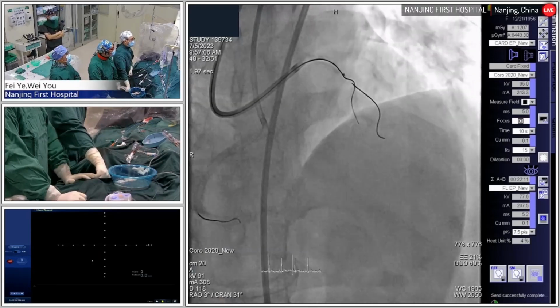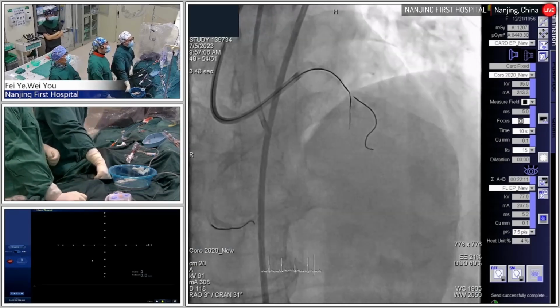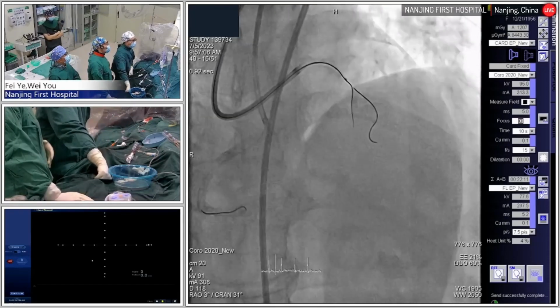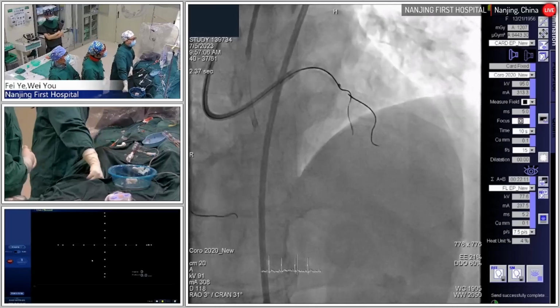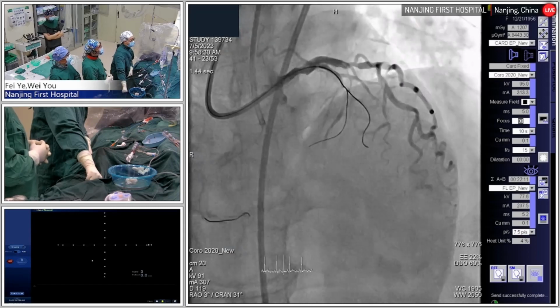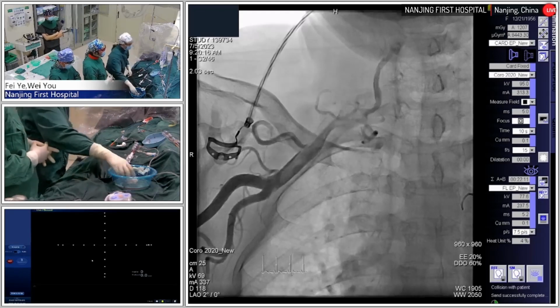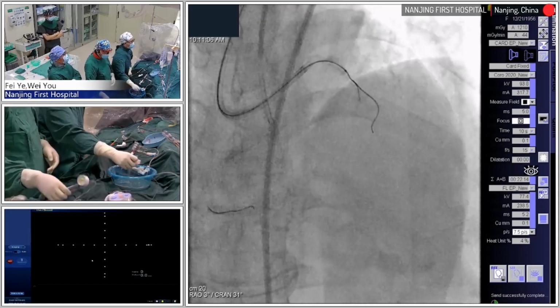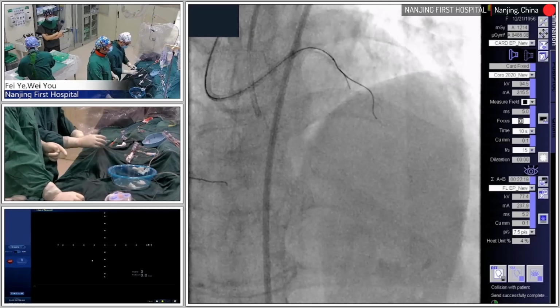But unfortunately, with the double lumen catheter, from the antegrade way, I also felt resistance. When I wanted to retrieve the KDL, I felt strong resistance, also a biting feeling. So next, please. I used a trapping balloon to retrieve the double lumen catheter. Next, please. Here is what we did just now: I successfully switched our catheter from the KDL to the Finecross single lumen catheter. That's what we did just now.